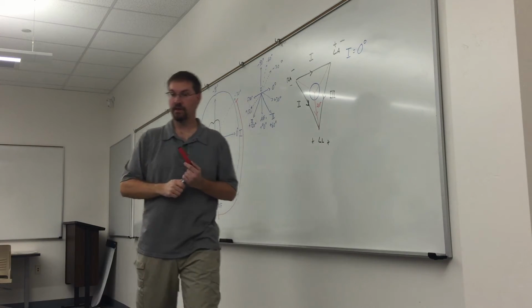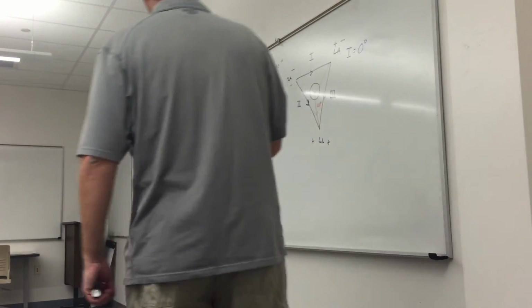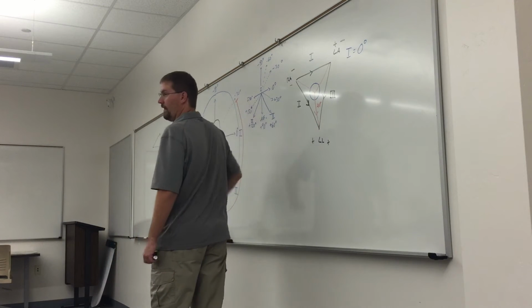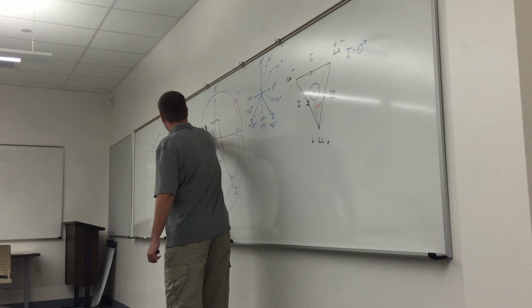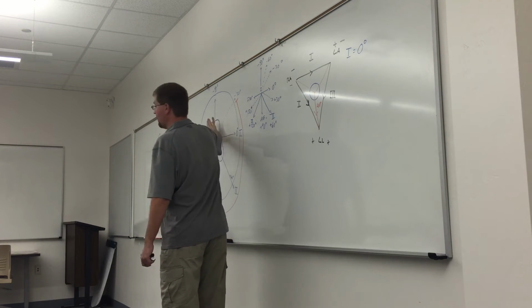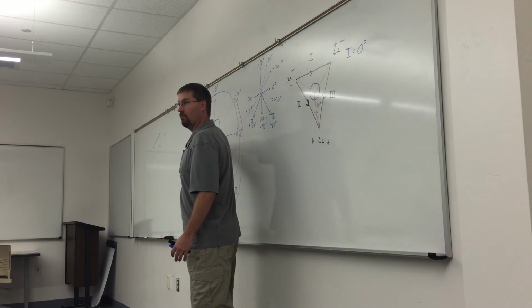That's normal axis. Now there is a subset of normal that is slightly shifted upwards. If you look at the heart, what side of the heart is this here? This is the left. What side is this here? Right. So if I shift upwards, my axis is going to deviate left. And if I shift backwards here, it's going to be right.